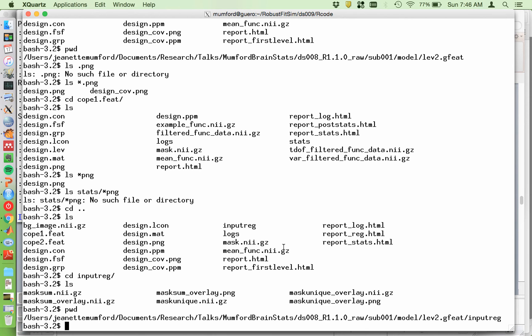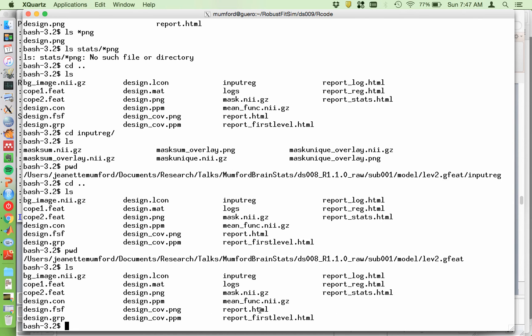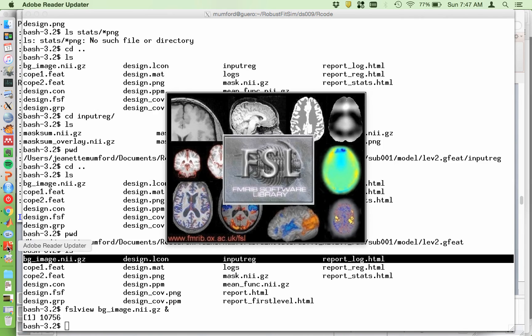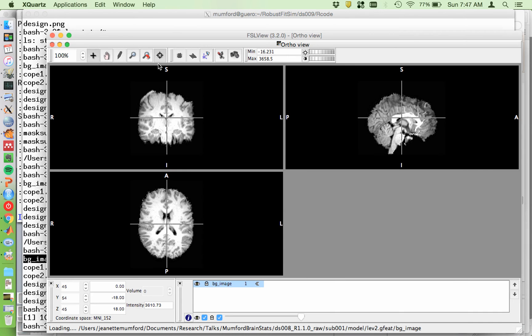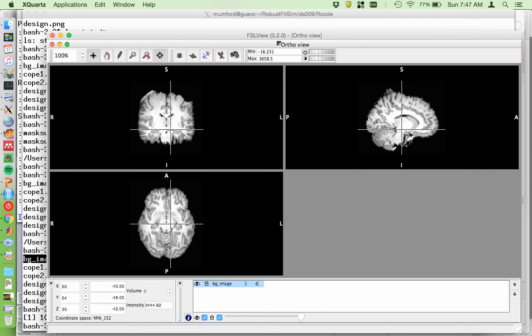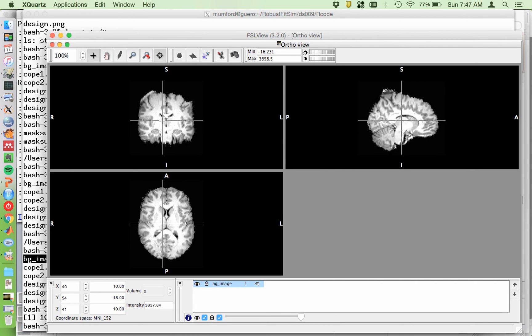So I'm in my level two directory here. I just grabbed subject one. You can see that I have a BG image. Whenever you get to a higher level analysis, if you ever want to display your stat images on anything, you use this BG image. In this case, it's just this subject's skull-stripped structural from the lower level analysis. For the third level analysis, this will be the subjects' structurals averaged — this is the first time we've had the structural in MNI space.